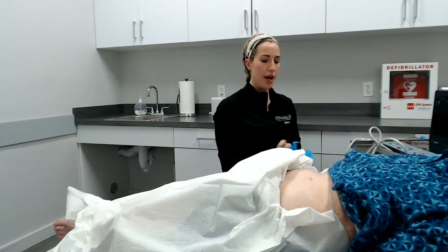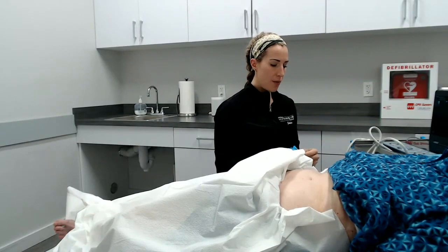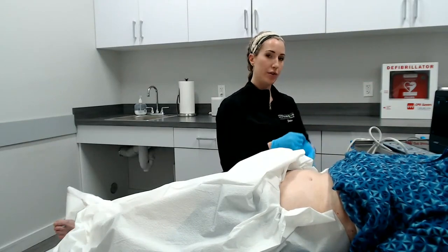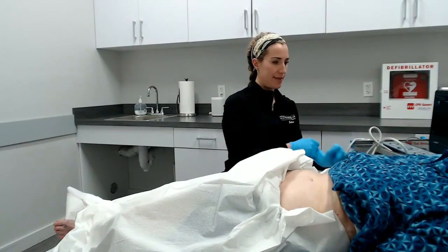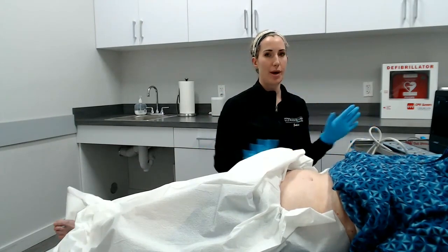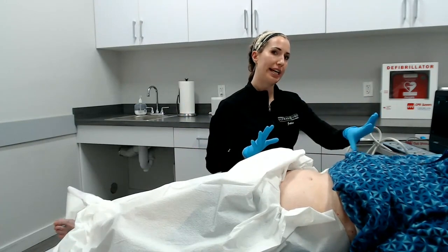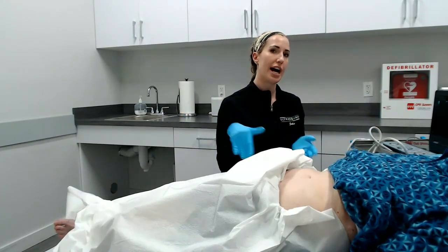So first thing I'm going to do is I'm going to do waveforms at the common femoral level because I want to make sure my outflow veins are good. And so we're going to do real-time information of that. Patient positioning is crucial as well. Right now I have Barbara in a little bit of reverse Trendelenburg, but I'm going to lay her flat for a second and just make sure her arms are at her side.